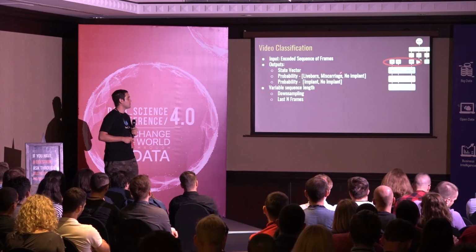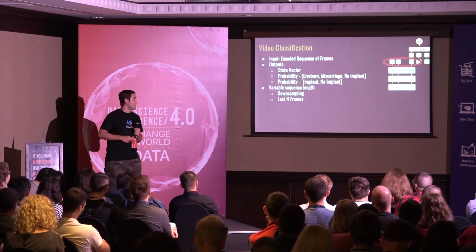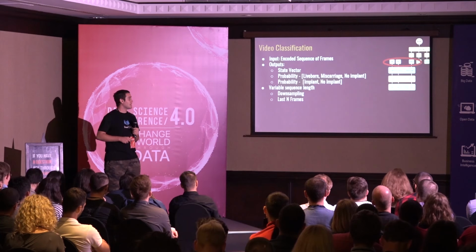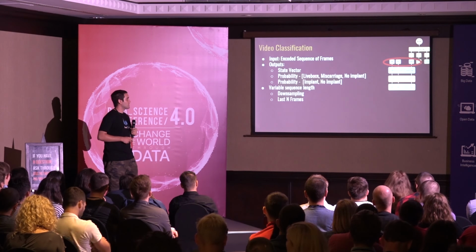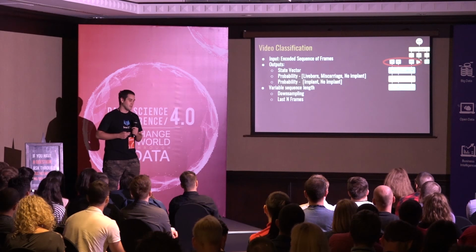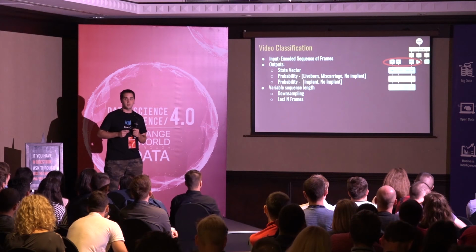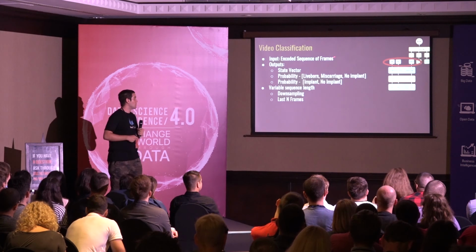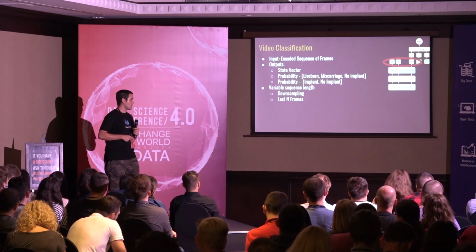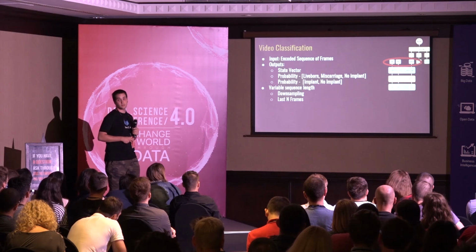We tried liveborn, miscarriage, and no implantation classification, but we realized that liveborn and miscarriage are very similar, and it is hard for the network to distinguish between the two. So we made two new classes, which are implant and no implant.